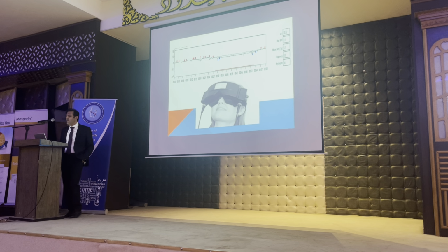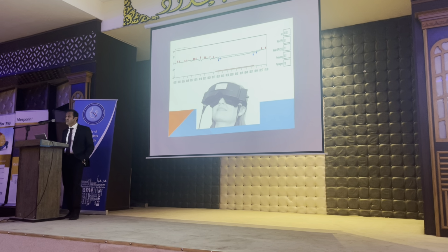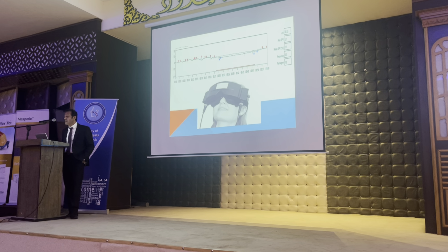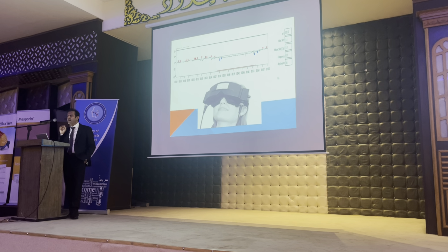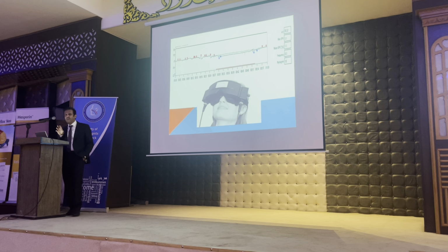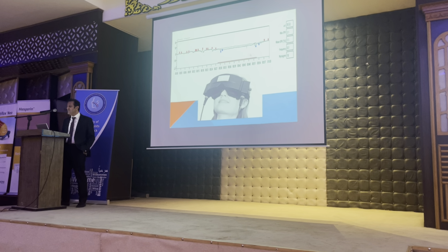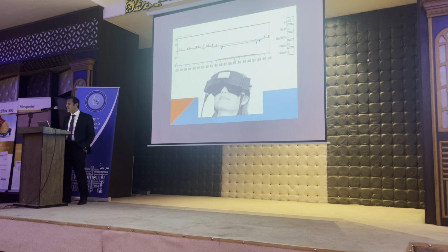So this is an example of spontaneous nystagmus. As you can see, the eye is covered. There is a right nystagmus, and if you can see this red light, it means that the operator has switched on a light inside the goggle. So it is induced gaze fixation here, and the nystagmus is diminished.